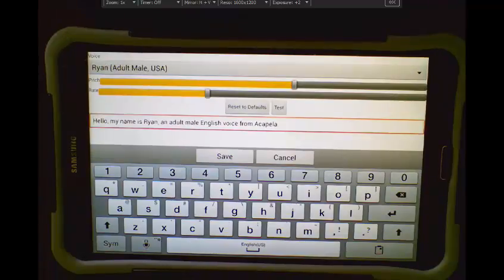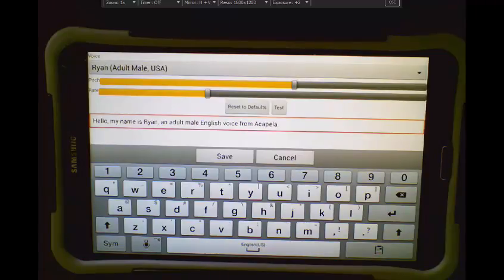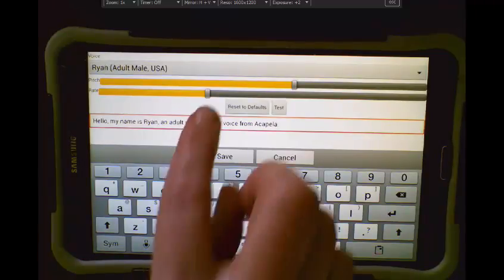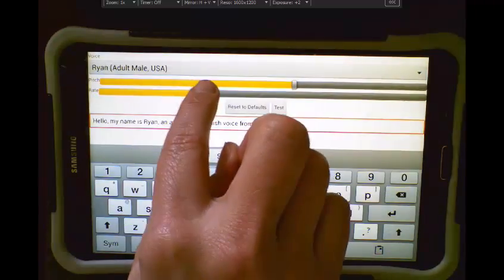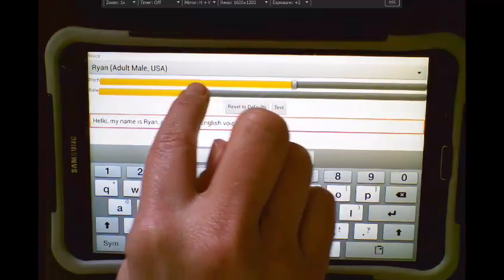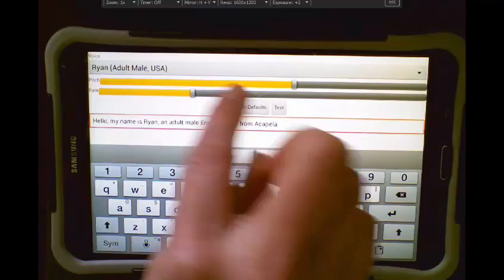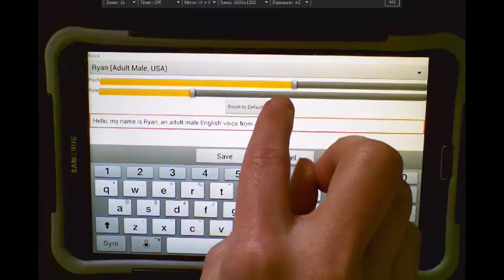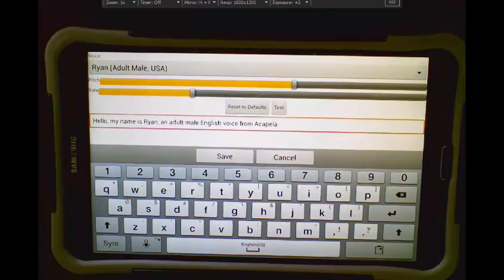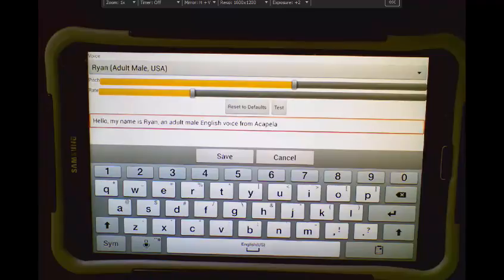Hello, my name is Ryan, an adult male English voice from Acapella. If I wanted to slow his rate of speech down, I can slide that bar back and test it. Hello, my name is Ryan, an adult male English voice from Acapella.